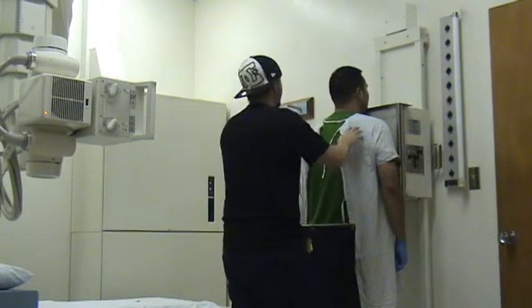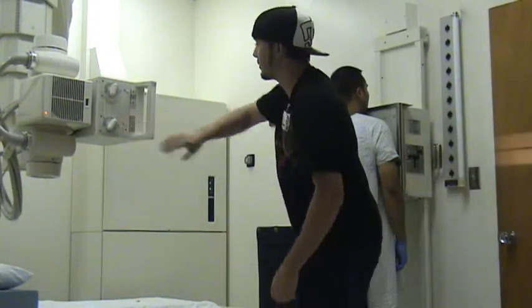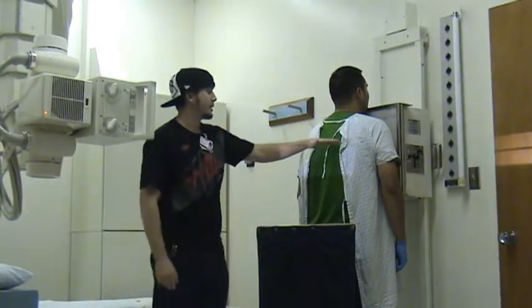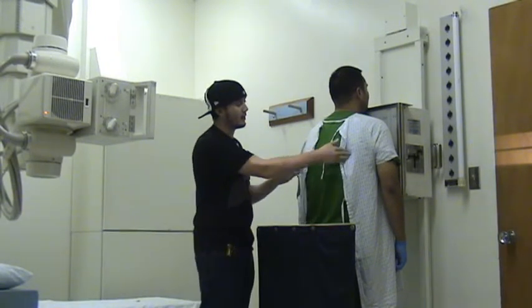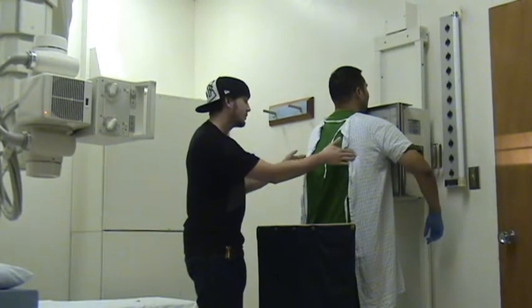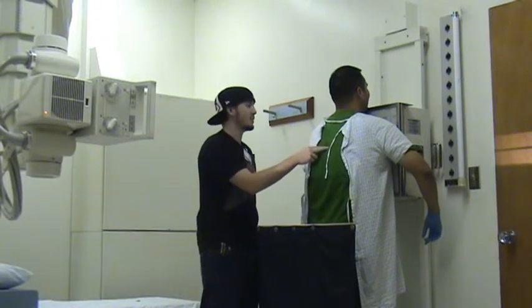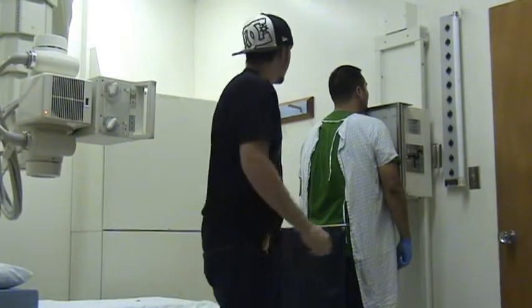Alright, so what you want to do is make sure that the collimation light and the CR are exactly at T7. Another way you can find out is to look at the bottom of the scapulas and feel around right here. Then you want to make sure that it's right there at T7, which it is right now. Alright, so it looks like we're ready for the x-ray.